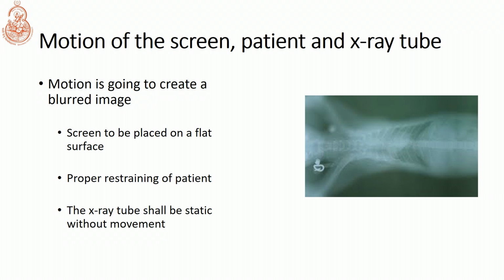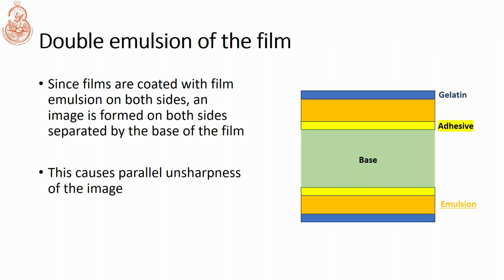So how can we address this? It can be addressed by placing the screen on a flat surface. It shall not move. The patient shall be restrained properly so that the patient will not move, and the X-ray tube shall also be kept static without any movement.